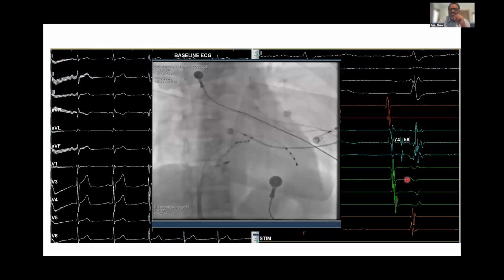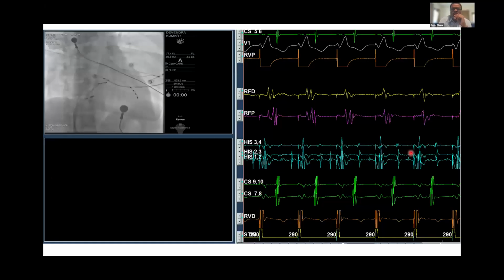Happening earlier in the right ventricle, we know it's the right-sided accessory pathway. Or whether in the retrograde direction, while pacing or during ectopy, we are able to show retrograde conduction happening. Instead of going through the normal retrograde conduction through the node, going through an accessory pathway and pre-exciting the left atrium, we may be able to see the atrial electrograms getting activated in the CS channel earlier than in a channel which is close to the AV node.